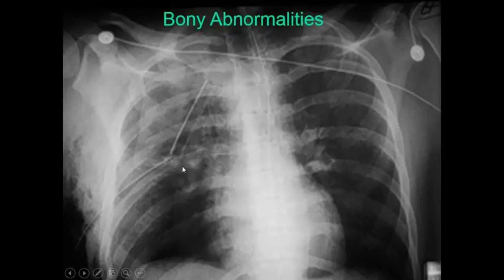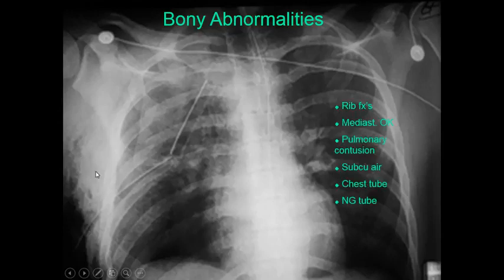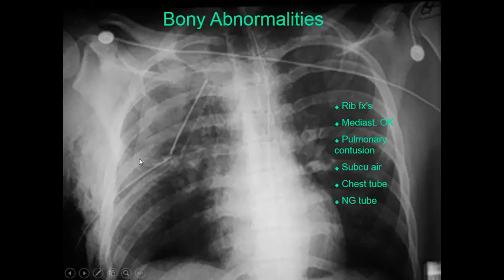The mediastinum may appear widened with pulmonary contusions and opacities in the lung fields. Other structures such as a chest tube and NG tube are also visible.